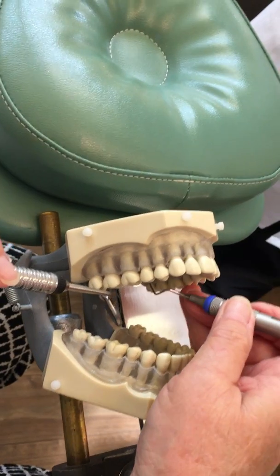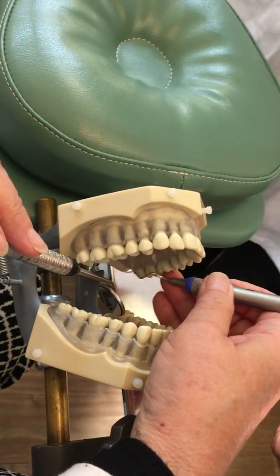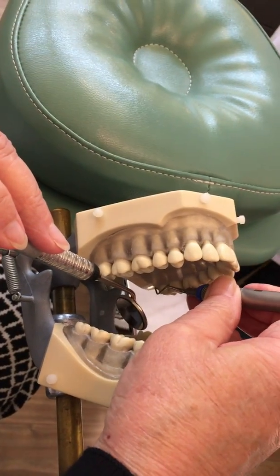Then we're going to go over to area six, stretch our fulcrum up, go in closed and then open — finger motion is allowed.